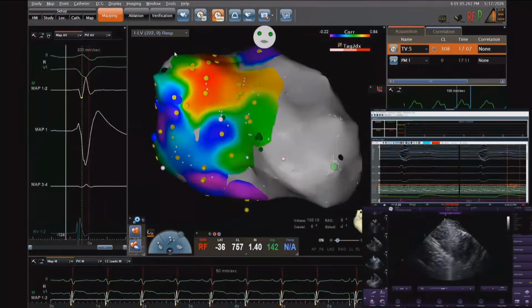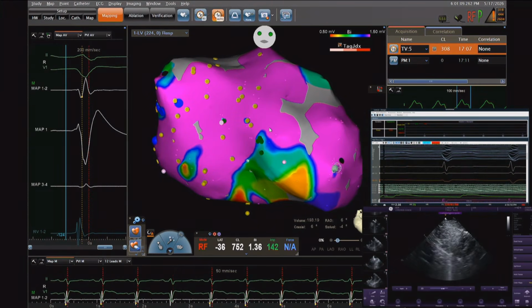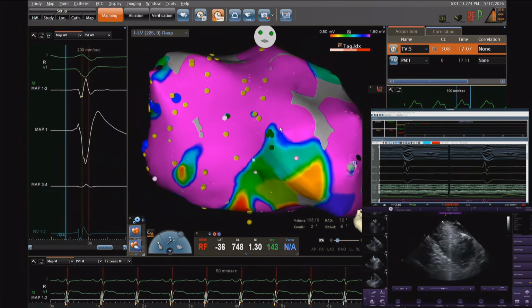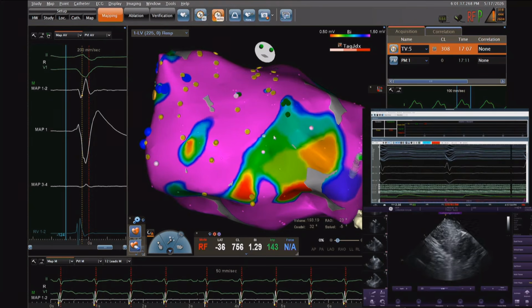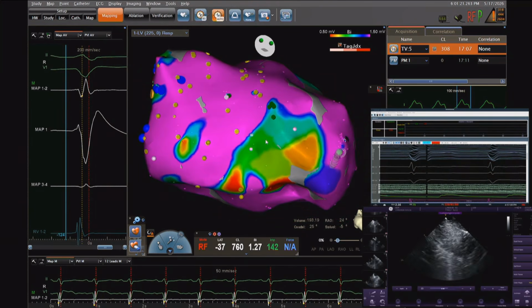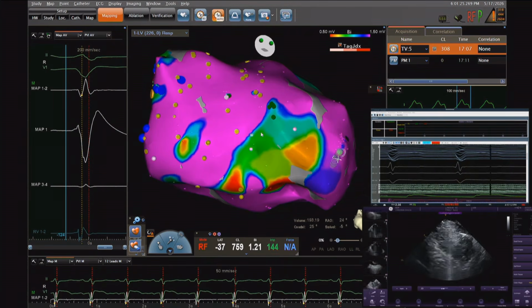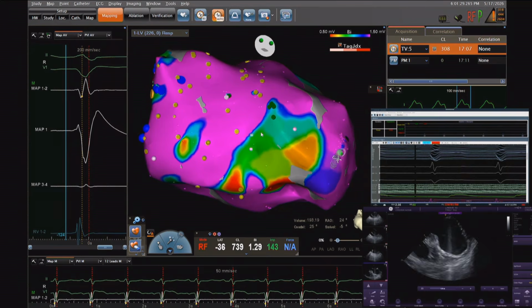Thank you. So basically, we did a transseptal puncture. We started to map the left ventricle. We have some nice images of the left ventricular scar. If you can show it, somebody, we recorded it for you. So now we are in the right ventricle with the ICE probe, but we were most of the time in the left ventricle. And there is a huge aneurysm anteroseptally going to the inferior wall.